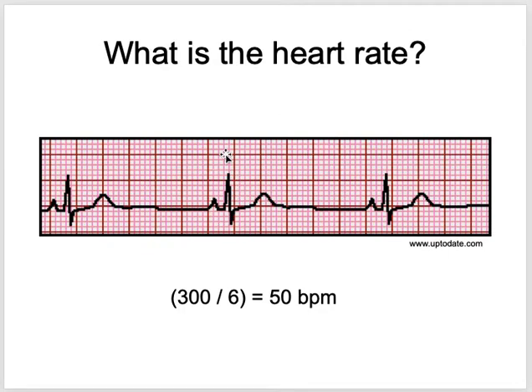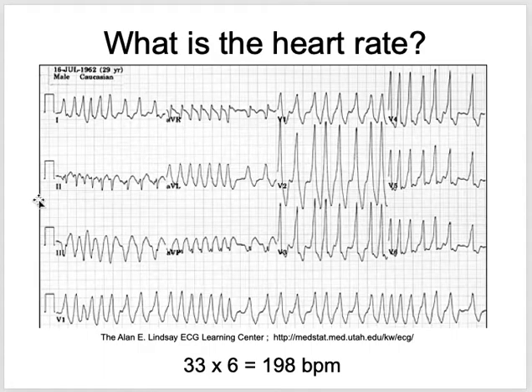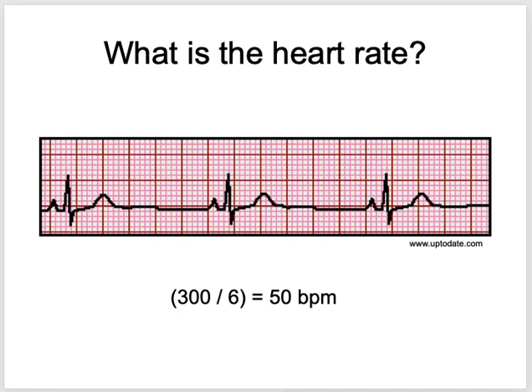Okay. So the best leads in which it is better to assess the rhythm are lead 2, V1 and V2. Okay. These are the good leads to assess the rhythm: lead 1, V1, V2 and lead 2. For example, in this one, V1, V2 and lead 2. Okay. So sinus rhythm is simply when the electric signal begins in the SA node.